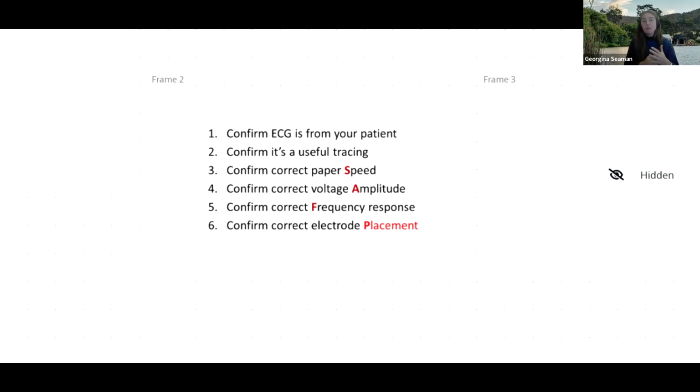In those cases, certainly in hospital, they change the calibration of the ECG machine so that they can see those waveforms more easily through things like adipose tissue or a larger barrel chest. So that's why we would change our calibration. But if we do that, it is important when handing over to hospital that you really highlight it, make it obvious, right all over the ECG machine: calibration is not at 10 mils or millimeters. So they're the sorts of reasons that we would change amplitude.